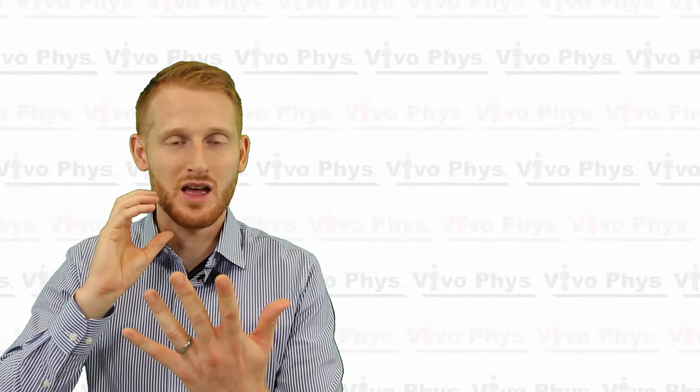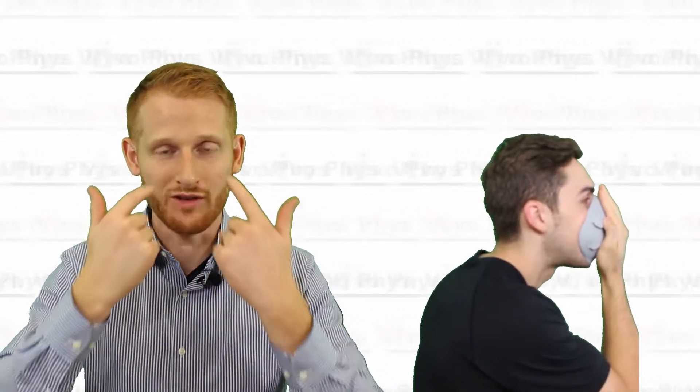To do the sizing, simply place the mask on their face and have them put a little pressure when doing so. Then use the palm of their hand to close off the air hole on the front of the mask so they can't blow any air out. Then they just try to do a light to moderate intensity exhalation to see if any air comes out around the mouthpiece—around the nose, the cheeks, or underneath the jaw.